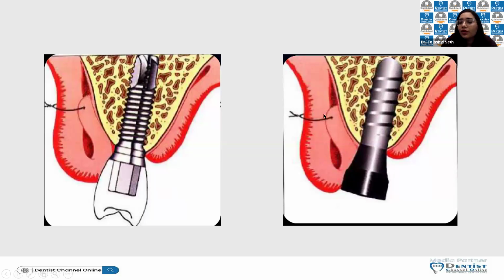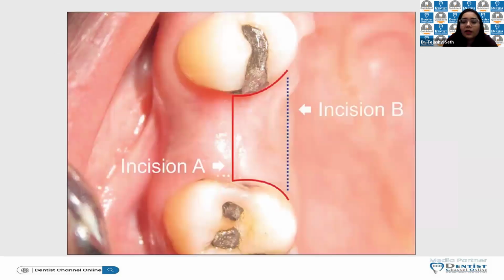If you're doing it during your second stage surgery, it might require more time, but during your implant placement, when you're doing a submerged implant placement, again, by the time the need arises to do a second stage or your prosthesis restorative phase, you will have a very thick gingival tissue on the labial aspect, so that will give comparatively better aesthetics.